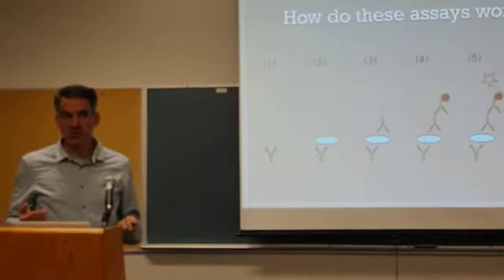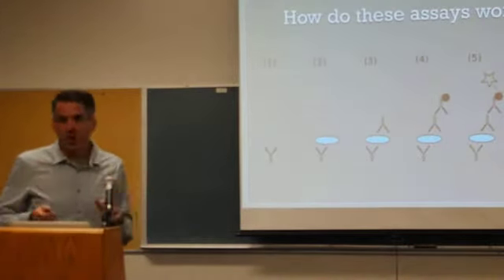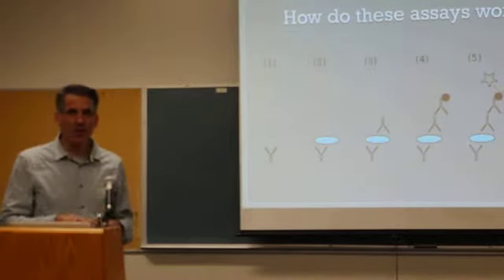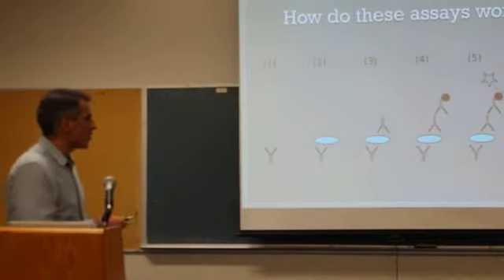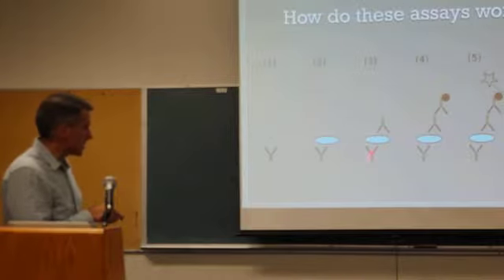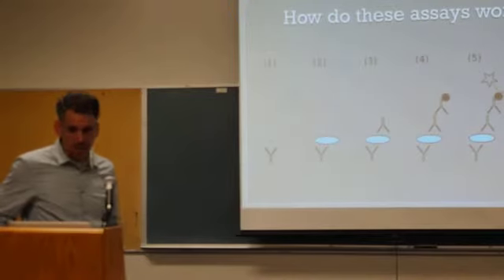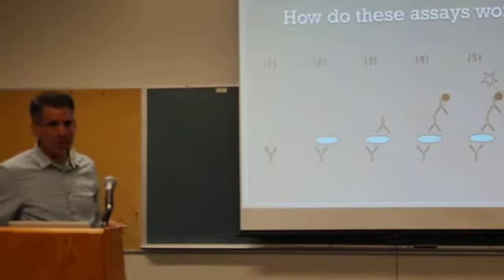Growth hormone is produced. That's how it's done. Now, it sounds really fancy, but I didn't have to do it myself because IDS ISIS manufactured it for me. We have done these kinds of assays from scratch in this laboratory, but most of the time, the production of those antibodies is prohibitively expensive, usually $50,000 an antibody to get those custom manufactured.